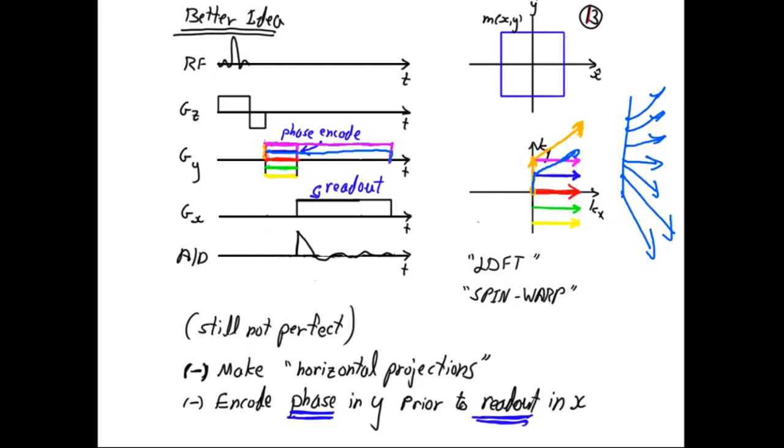But the idea here is that where you are in the frequency domain is really the integral of your gradient, if you think about it. Like moving here, it's basically the integral, right? If this is on, then you integrate over that, so you're moving in k-space.